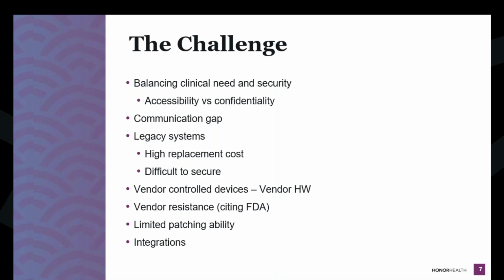Do we as an organization assume the risk by saying, we're putting our antivirus on, we acknowledge you haven't tested it, but it's probably going to be fine? Maybe it's not, right? That's something that you can test when the vendor brings you the piece of equipment before you deploy it. Your intake, your initial inspection, you can test the equipment with that antivirus on it, for example. Scan it, run a vulnerability scan, right? That's the perfect time. The vendors tell you, we can't scan the equipment, but that perhaps is your perfect time. Test it, push everything you can to this device at that time to see what's going to break it. And then maybe don't buy it if it does break.